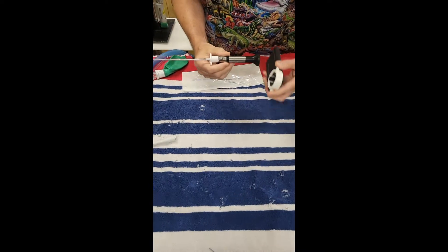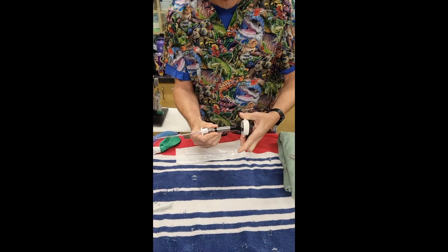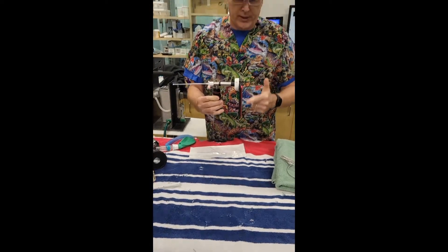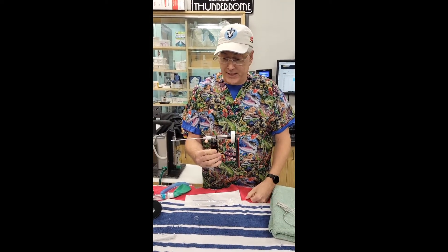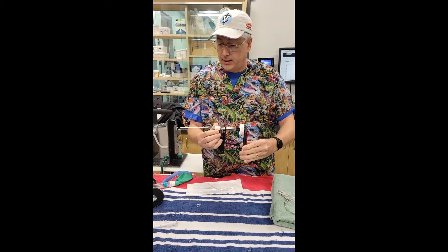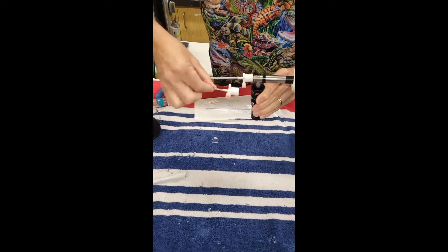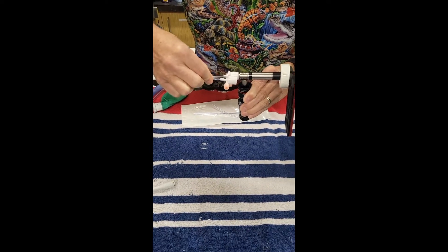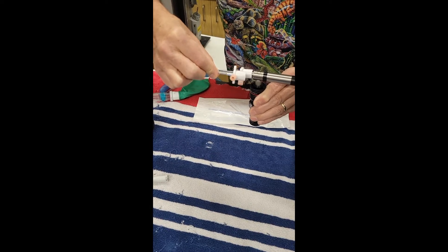So that I can teach everybody what I'm doing, we will have video split screen showing me doing it. I'll be able to record it with this Vetovation iPod iPhone adapter — this is what we'll be using today for our endoscopy. We also like to do some capnography, so we have added a custom endotracheal tube adapter for sidestream capnography.